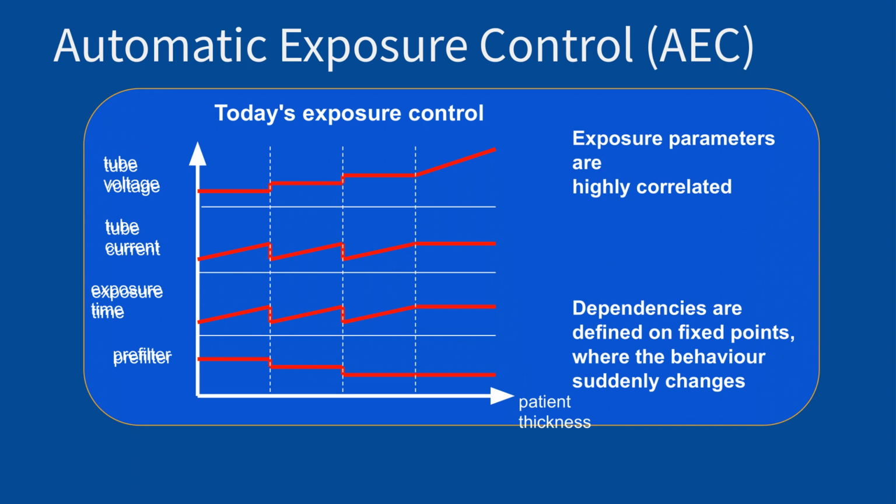The one thing that is difficult to change, the one parameter, is the filter that we use to filter the X-rays. So there's usually several different types of filters in any given device, and they can be electronically switched out. But you only have 4, 5, or 6 of those at your disposal, so the machine can change those, but that is going to be one of the factors that is most difficult to change. Tube voltage, tube current, and exposure time obviously can be dialed much more accurately electronically.